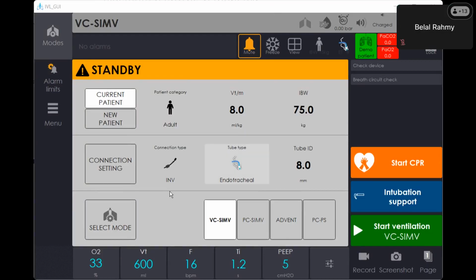As soon as we start our ventilator, it is very important to perform some obligatory steps in setting up the machine, because this is a life support device, and the most important thing is to make sure it is working correctly. There are no issues in the hardware or the software, all the sensors and tubing are connected properly, and the device is ready for life support. Patient safety must not be compromised due to misuse, misconnection or malfunction of the ventilator.